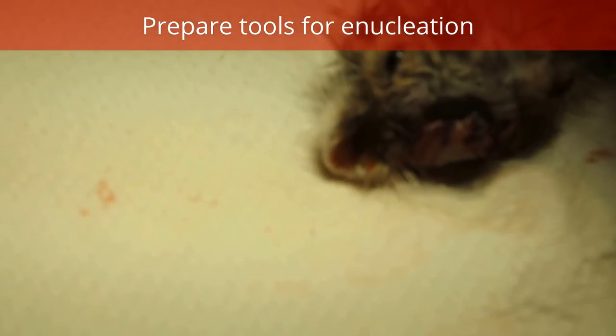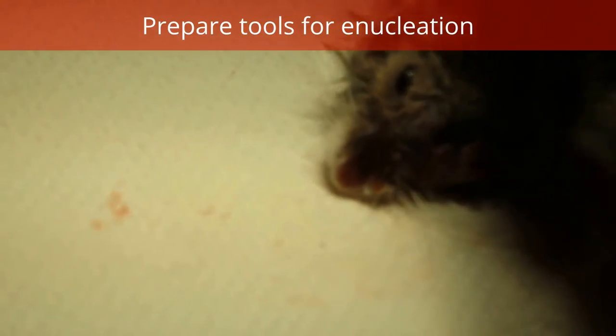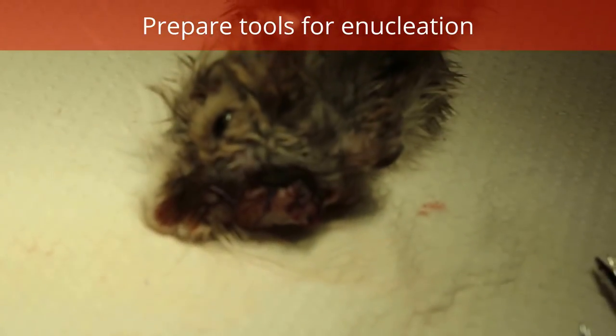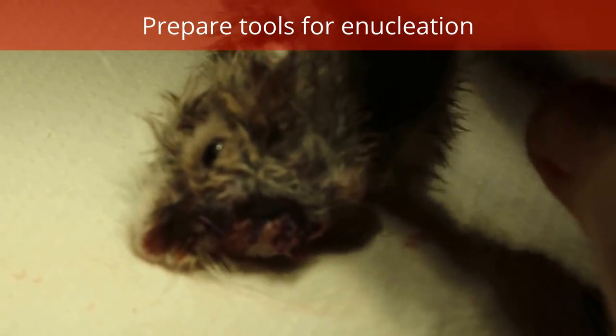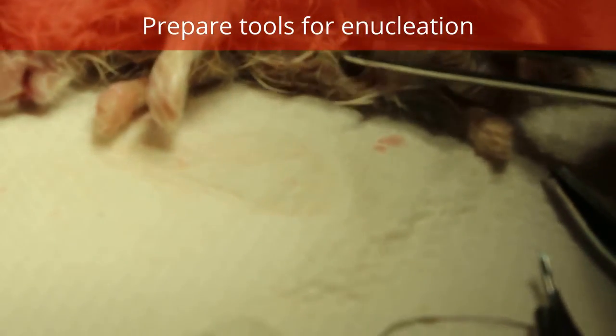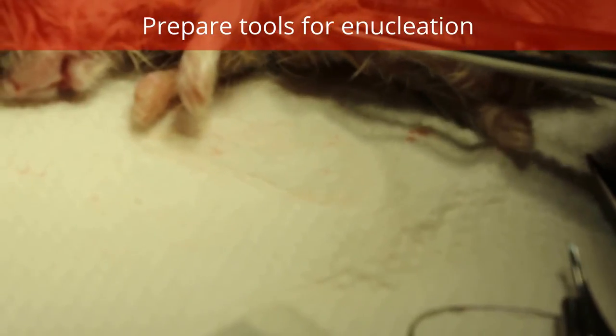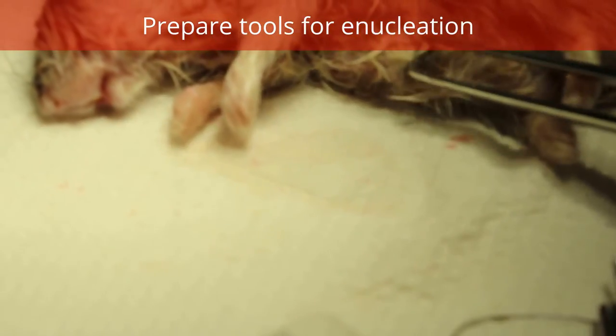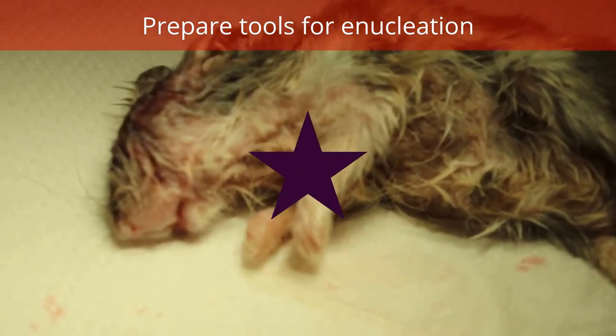and wake up. But after, you can see it's really quite thin when it's down under anesthesia. For 36 grams, it's thin. Let's see. Other than that, he's okay. Now there's some dirt here. The scent gland is dirty here, so we'll try and clean it up for him at the same time. Clean up. So that's the end of the surgery.